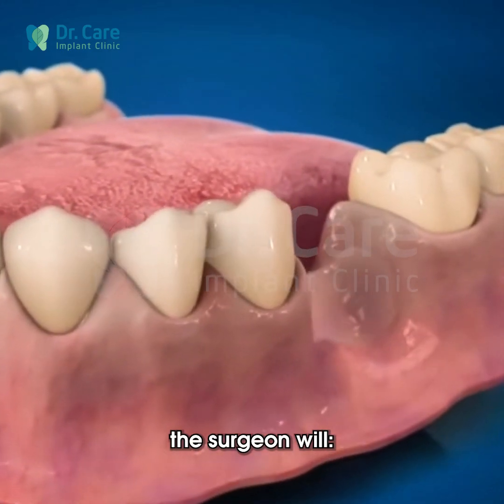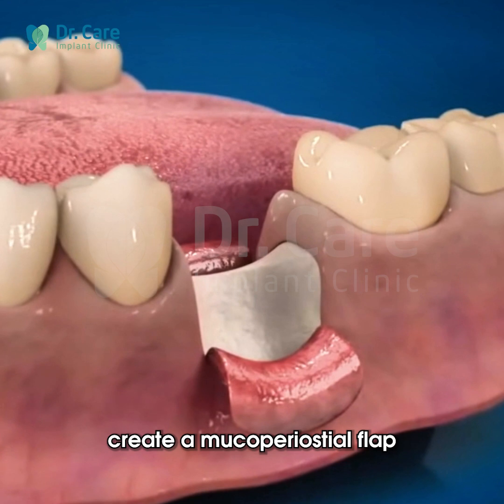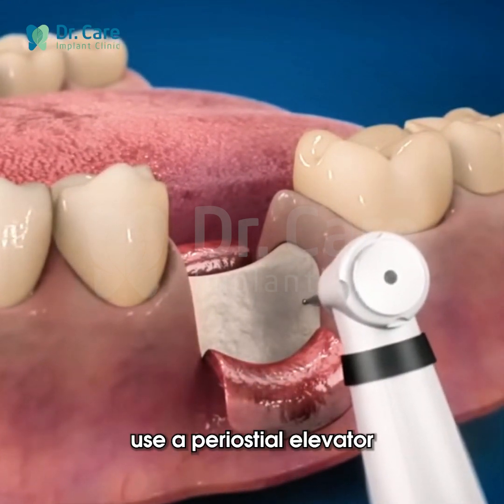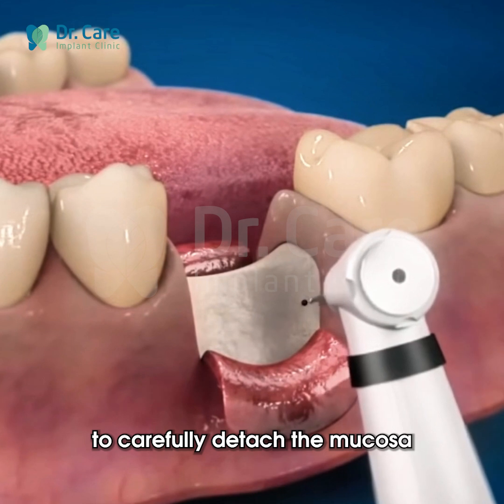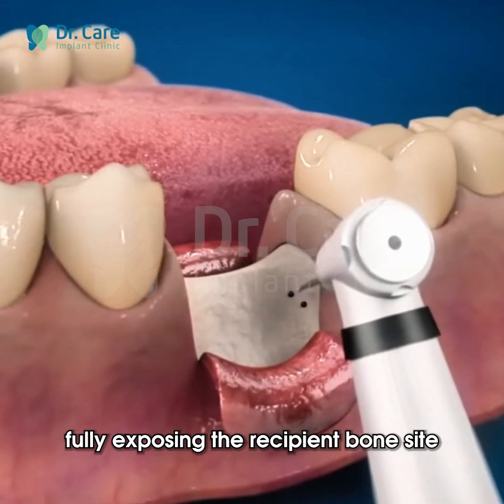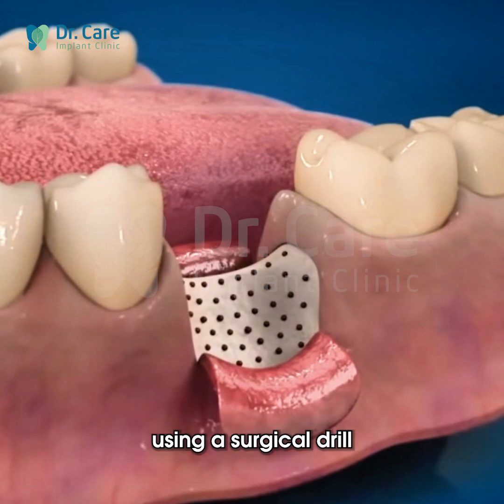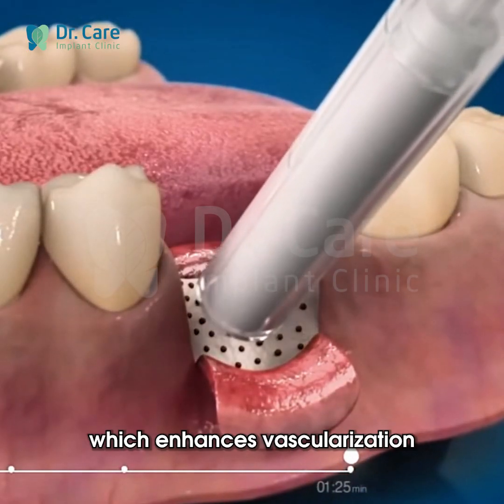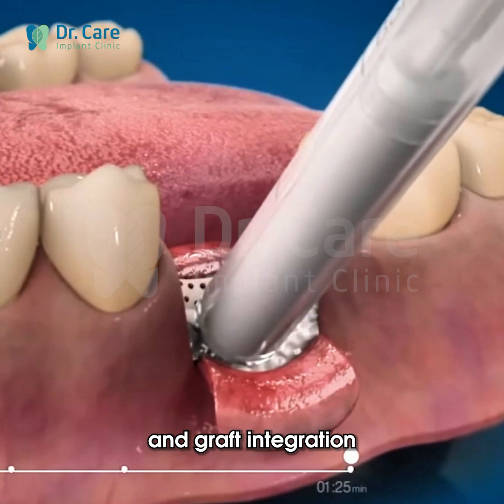The surgeon will create a mucoperiosteal flap using 3 precise incisions. Use a periosteal elevator to carefully detach the mucosa and periosteum, fully exposing the recipient bone site. Perform decortication using a surgical drill to create multiple bleeding points, which enhances vascularization and graft integration.